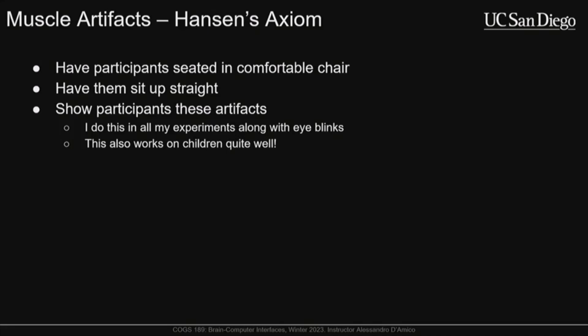Can you re-reference the EEG data to, let's say, the eye tracking data? Is that something you can do? Like, if you can measure the amplitude, you just take it out by referencing it? So the question is, can you re-reference the data to the eye channels?